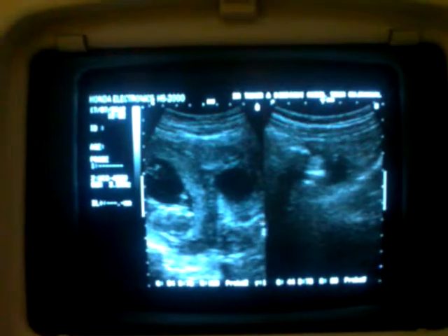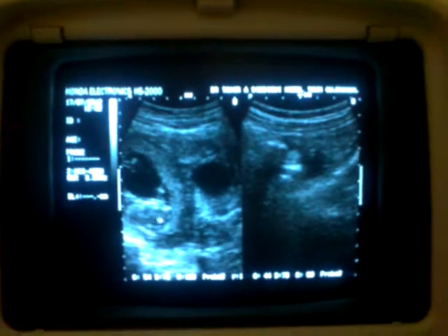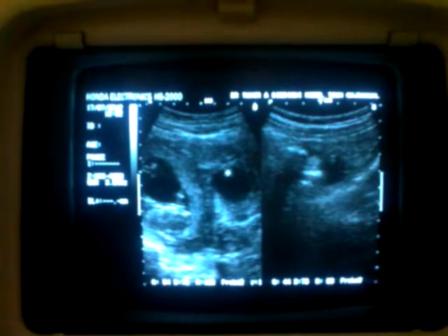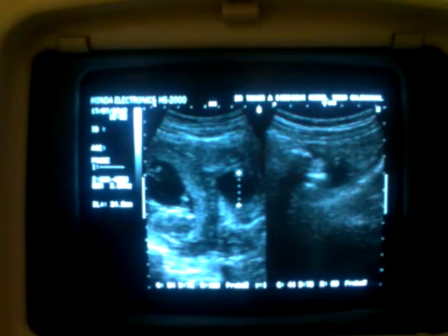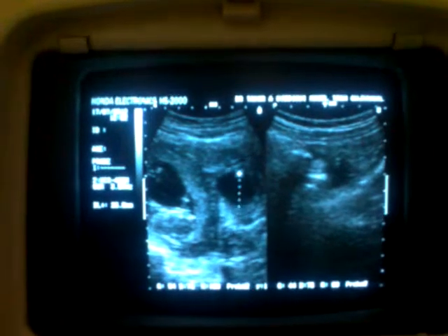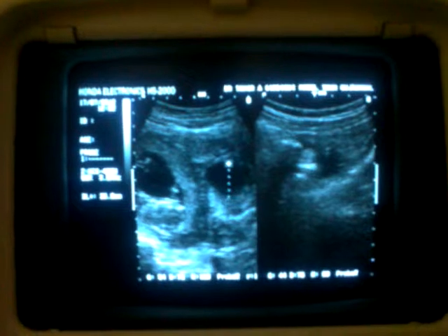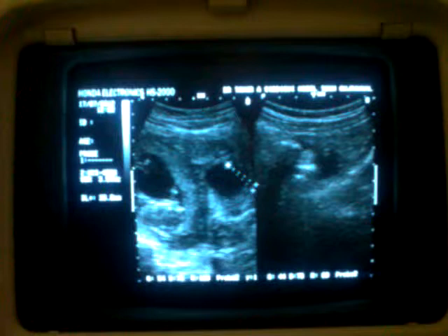This is the subseptate uterus with myometrium, with an intact 13 weeks pregnancy in one endometrial canal, with the second one showing a gestational sac of 24 millimeters, or rather 25 millimeters, with no fetal pole, suggestive of either a blighted ovum or a resolving twin or a missed abortion in this case.